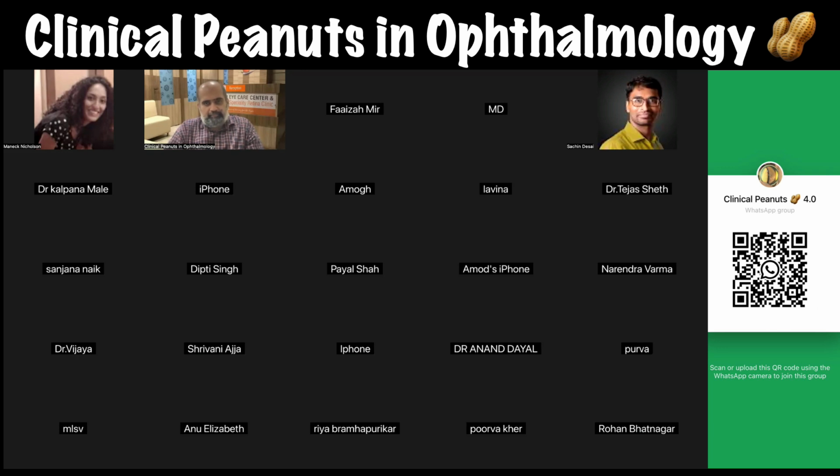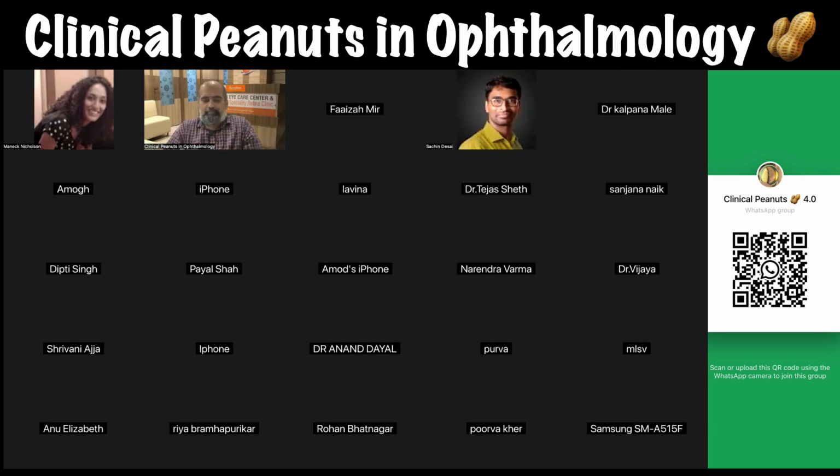So 0.75, just off the bat, I might not really think about placing a toric lens, because the patient might not see the value in correcting that small amount of cylinder with the toric lens. Most lenses, and I can share that table with you, start at around 1.5 diopters of cylinder, and the smallest amount of cylinder corrected on the cornea was around 1.03 at the corneal plane.